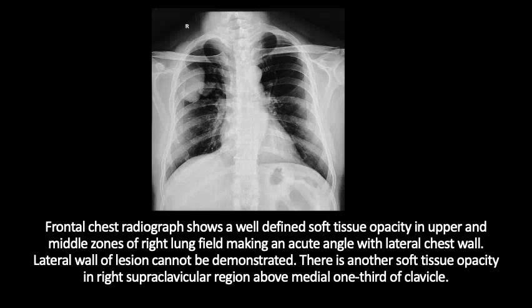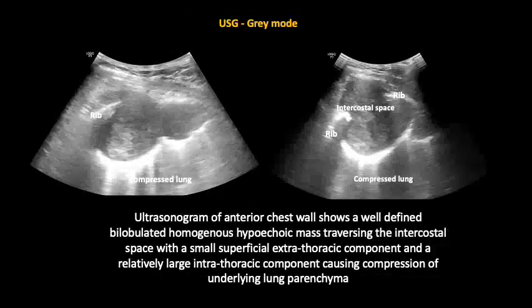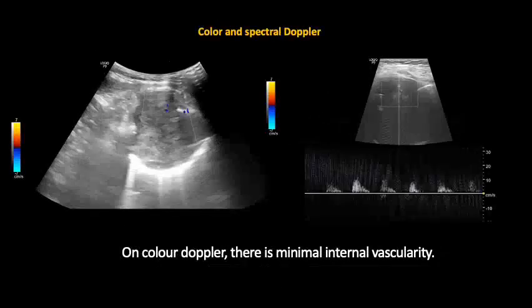An ultrasound was performed as the swelling was superficial. The ultrasonogram shows a well-defined bilobulated, homogenous, hypoechoic mass traversing the intercostal space, with a small superficial extra-thoracic component and a relatively large intrathoracic component causing compression of the underlying lung parenchyma. Color Doppler and spectral Doppler showed minimal internal vascularity.